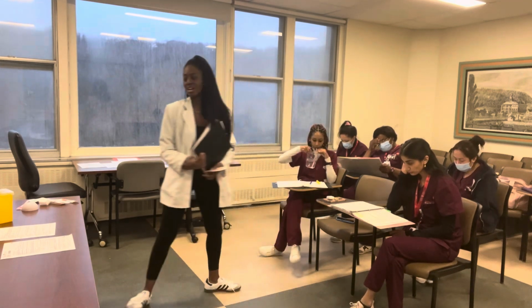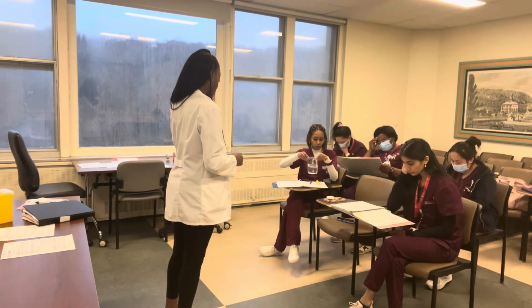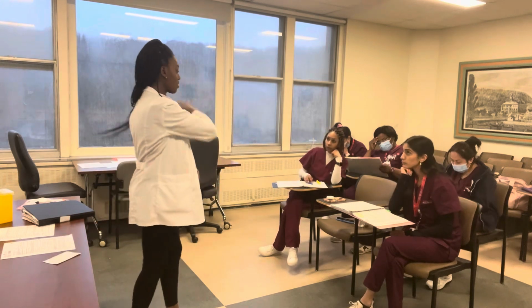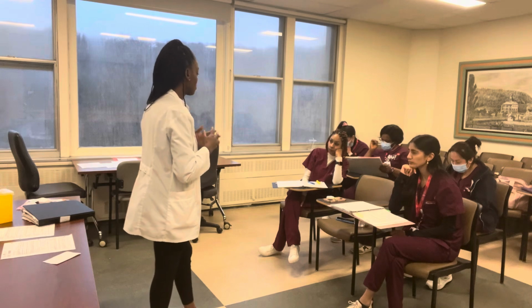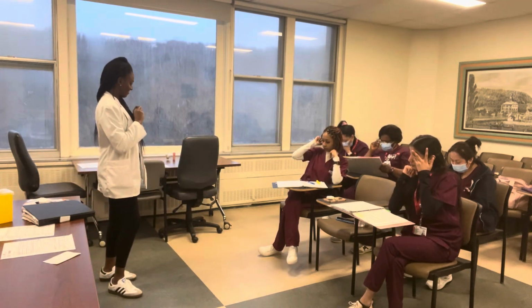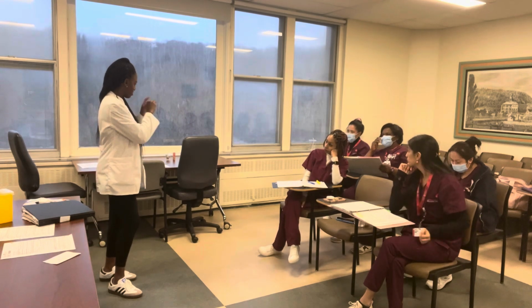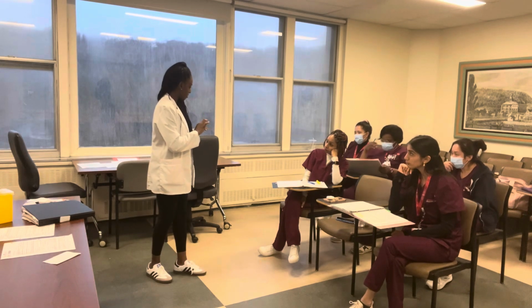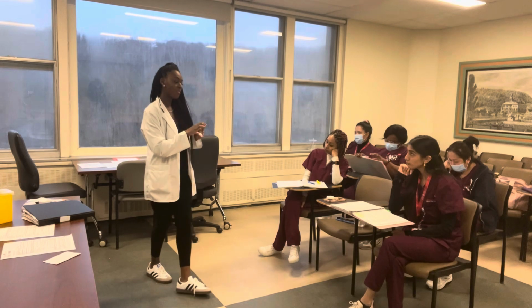Perfect. So now you've all started step 1, which is learning how to read for the AM dose all the way through. That's just step 1, finding the right amount to administer. The next thing you would do is create a label. You put the patient's name. I'll give this to you after, and then you'll practice. You write down how much insulin you're going to give: Humalog, 6 units, Lantus, 14 units.